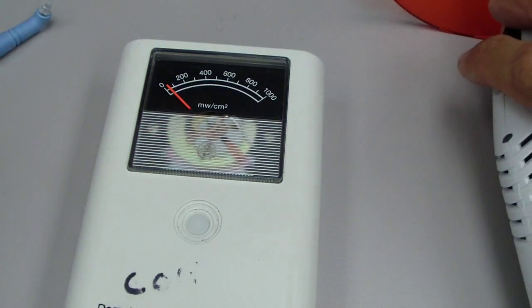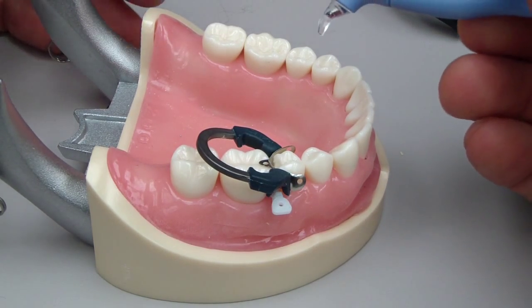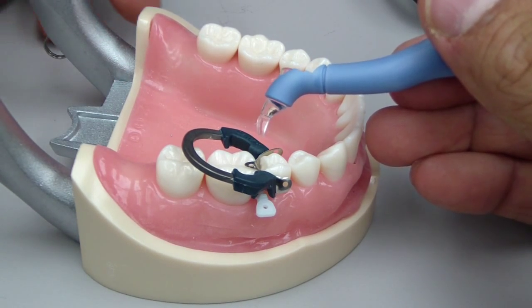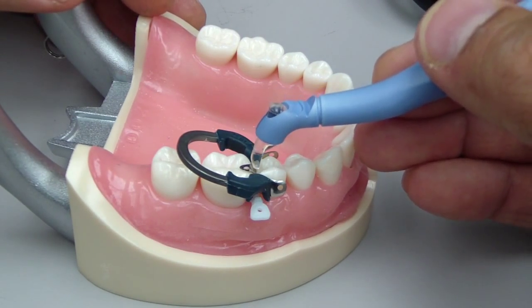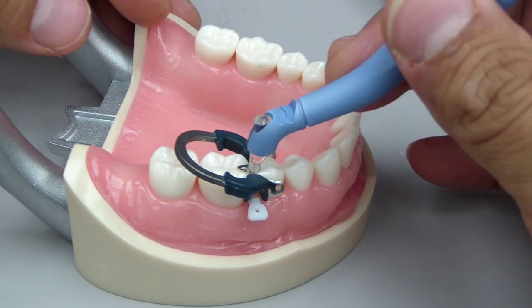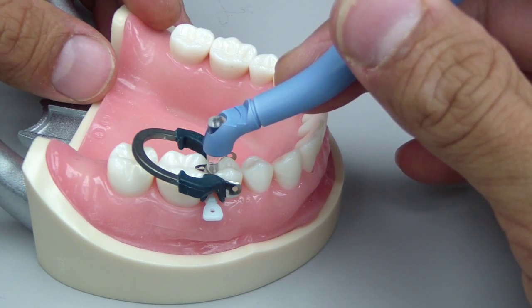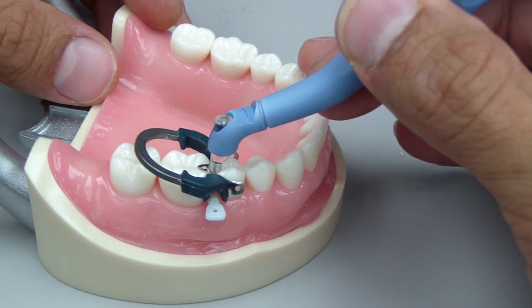So what does that mean? From this mini experiment, it seems that perhaps we're not obtaining the proper amount of light transmission through this instrument in order to fully cure our composite that's placed at the gingival portion of our proximal box, surrounding this light tip.